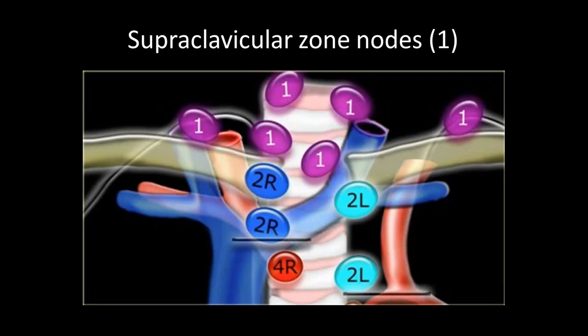We are okay with this group, right? Let's have a look again at this illustration. This is the same illustration, but here it's magnified on this portion. So these are the supraclavicular lymph nodes below the cricoid cartilage and above the clavicles and manubrium of the sternum, right? By the midline, they can be divided into left and right.